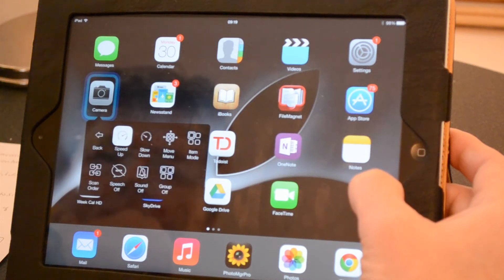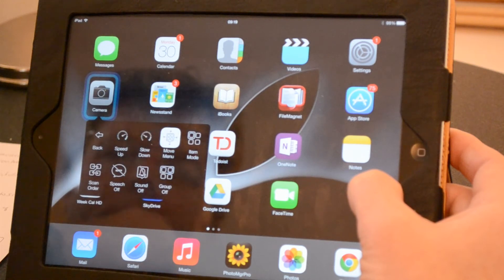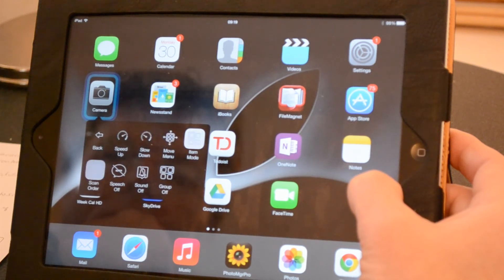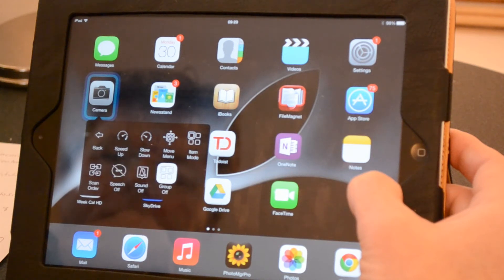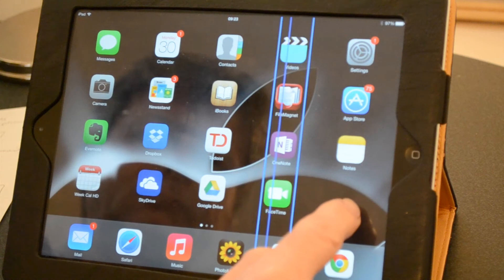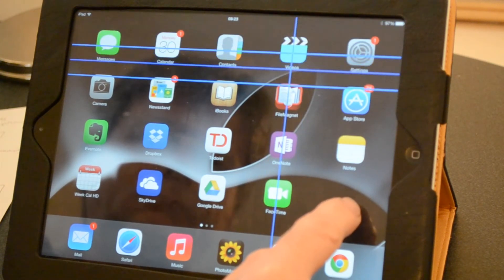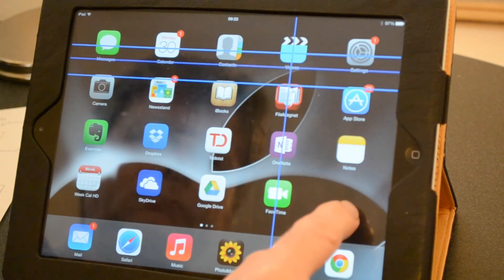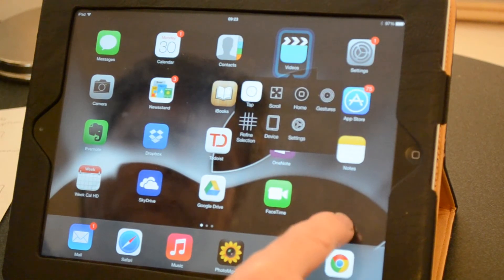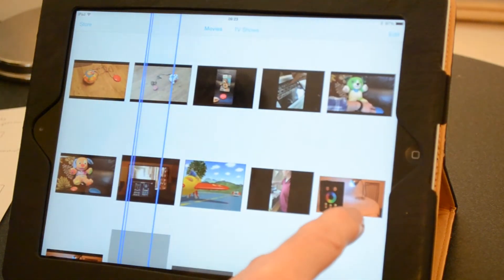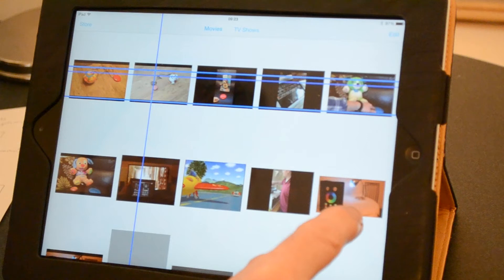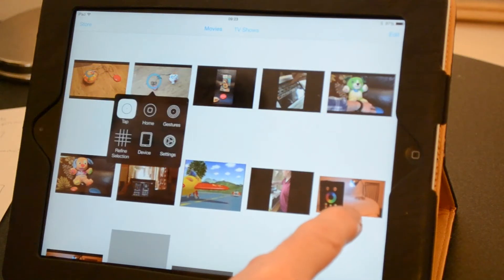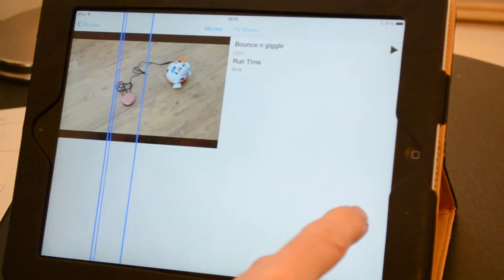Here I'm using the sub-menus to switch to an alternative to auto scanning which is point scanning. This uses a system of crosshairs for the user to pinpoint the area of the screen they'd like to select. This requires a good sense of timing and a little practice. Here I'm using it to select and play a video.